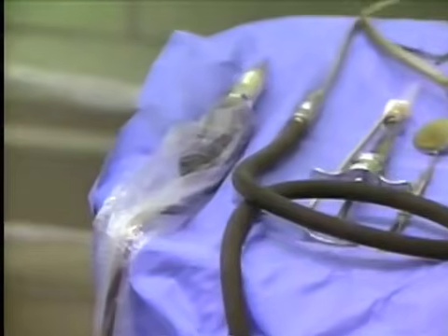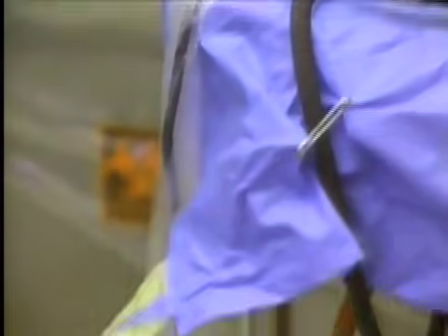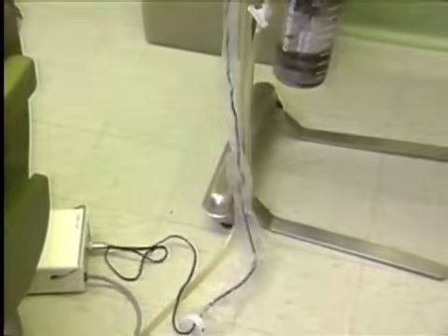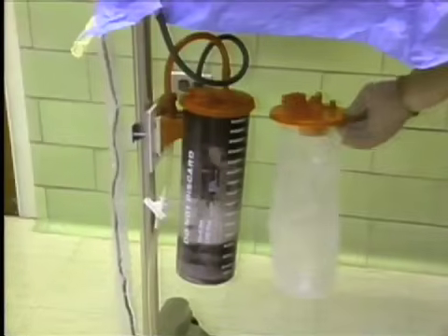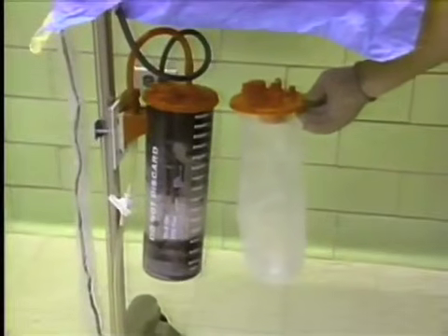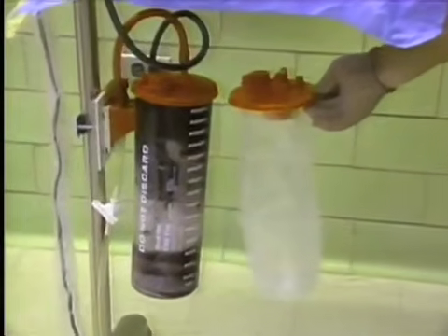The handpiece will be draped with a sterile sleeve. The blood products will be collected in a disposable container beneath the Mayo stand.